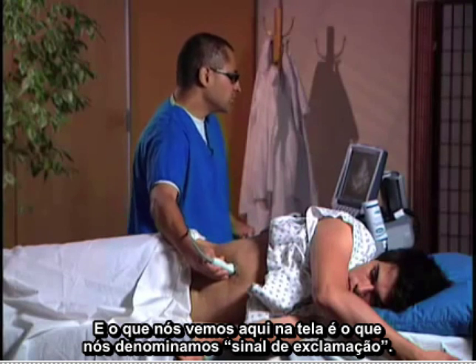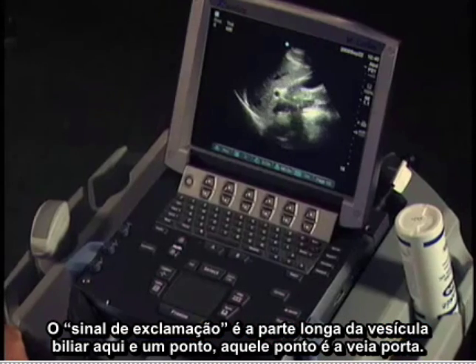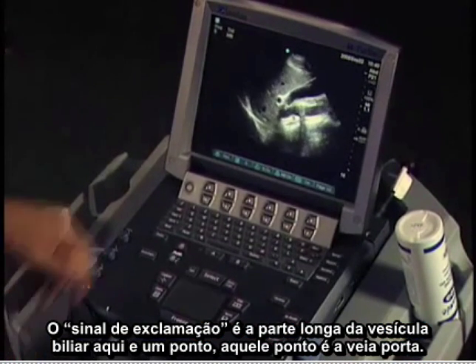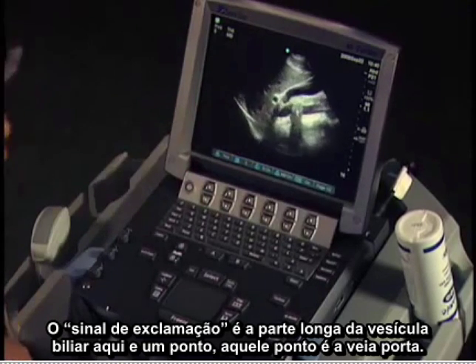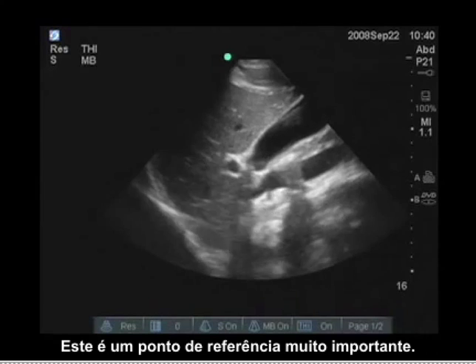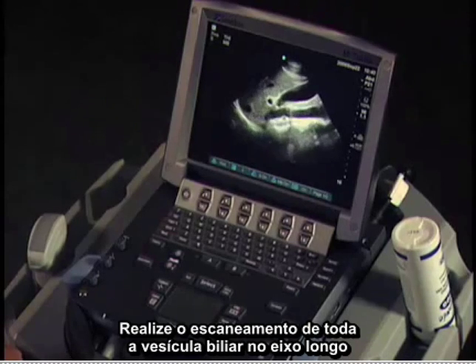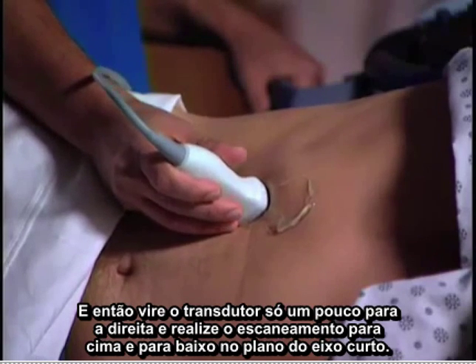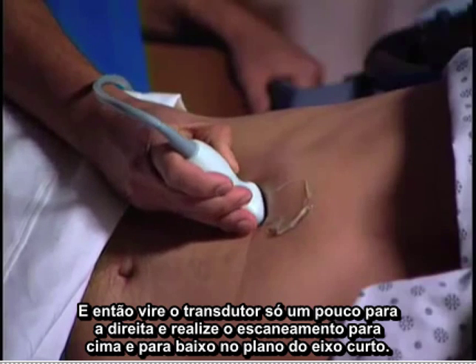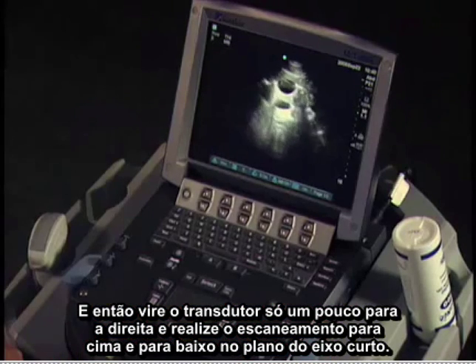What we see here on the screen is what we term the exclamation sign. The exclamation sign is the long part of the gallbladder here and a dot. That dot is the portal vein. Together, that is a very important landmark. I'll be scanning through the entire gallbladder in a long axis fashion, and then I'll turn the transducer just a little bit to the right, and I'll start scanning up to down in a short axis plane.